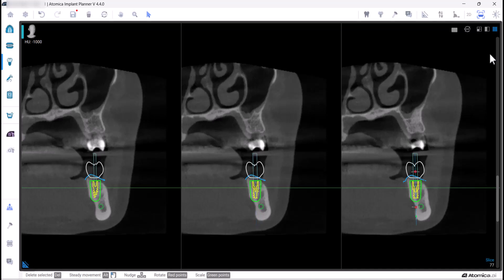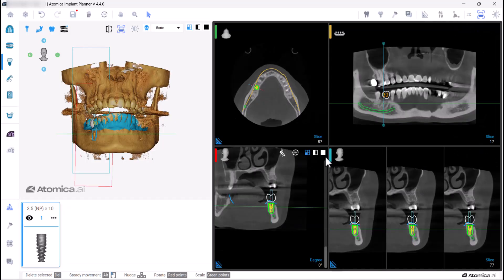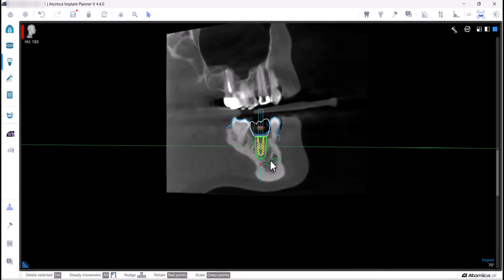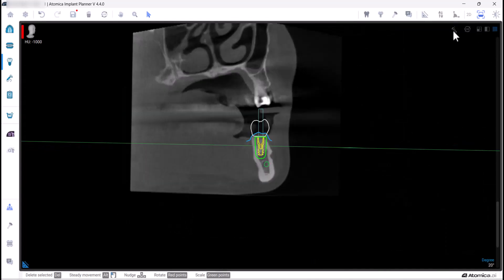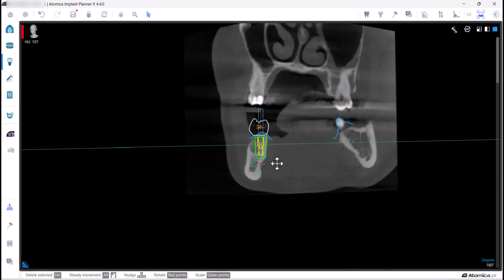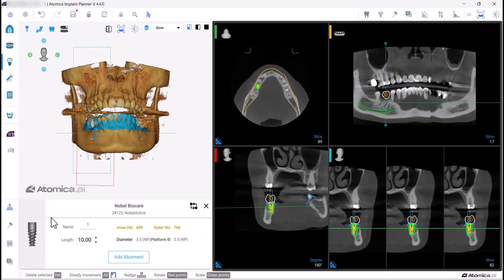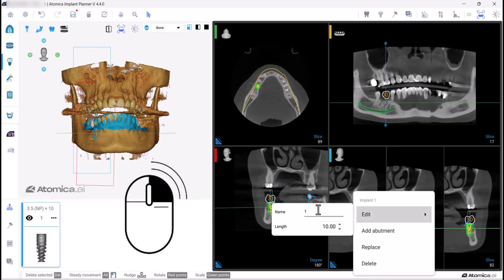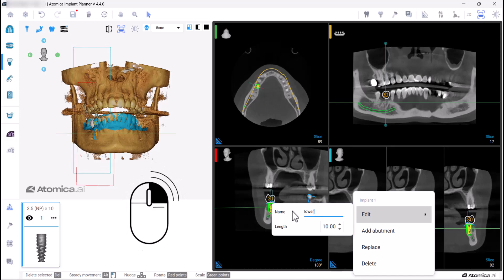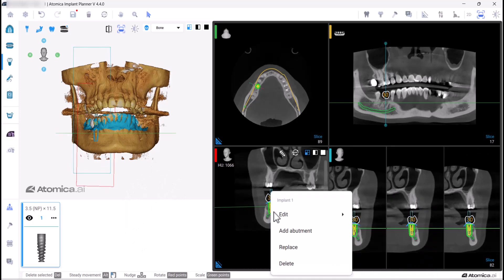Check your implant position all around using centric and tangential lines. You can find all the implant info in the implant card, or by pressing right-click on the implant itself, where you can name the implant and edit it.